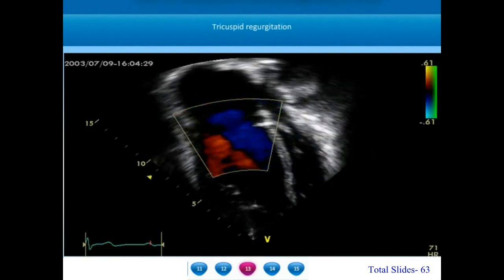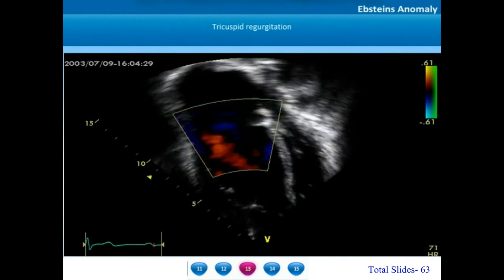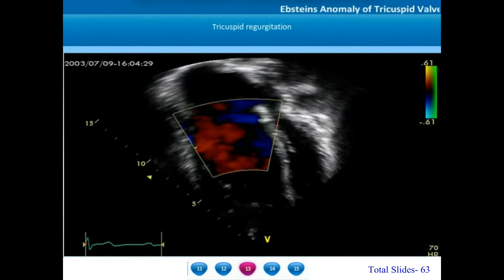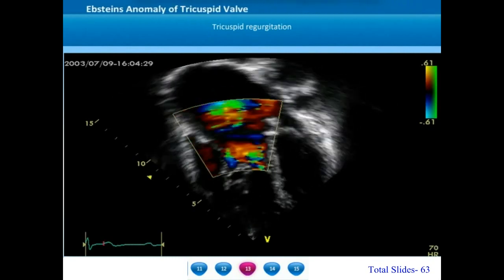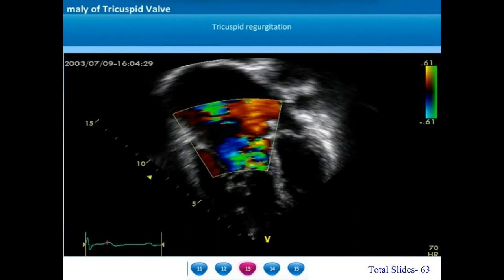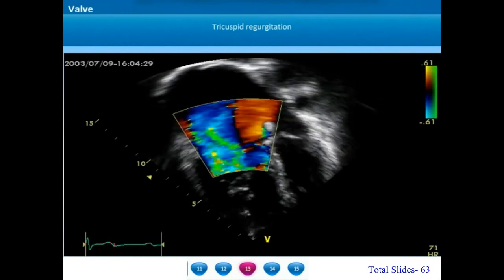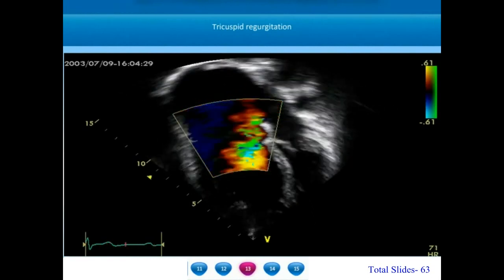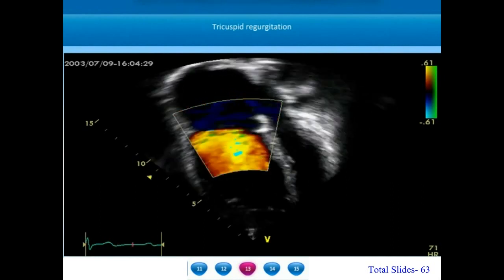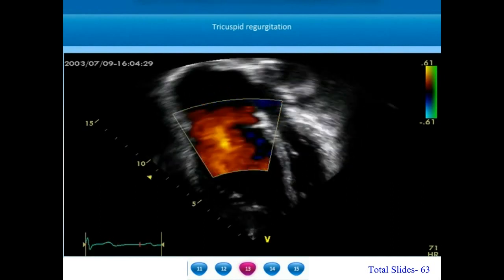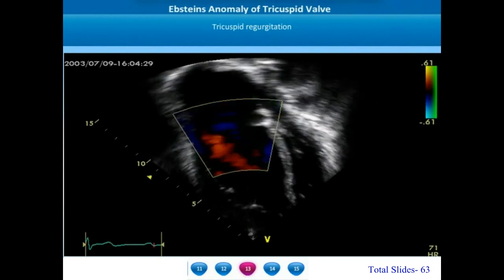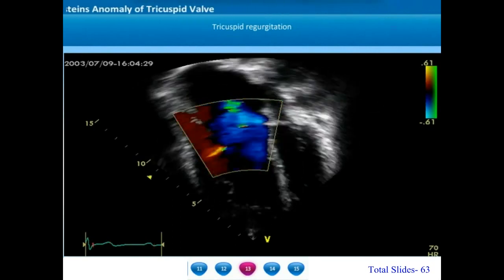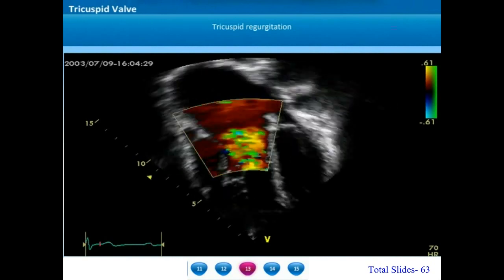The diagnostic feature of Carpentier type B Epstein's anomaly is the mobility of the anterior tricuspid leaflet. The tricuspid regurgitation may be very variable in the various types of Epstein's anomaly. Since the repair of Epstein's anomaly is primarily dependent on the mobility of the anterior tricuspid leaflet, even though there is severe tricuspid regurgitation, these valves will be repairable and are grouped under Carpentier type B.